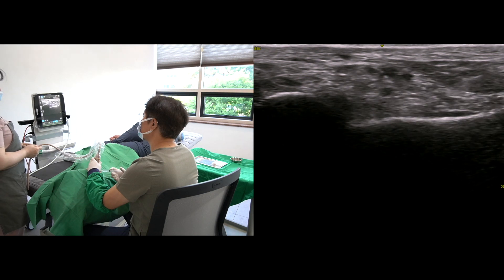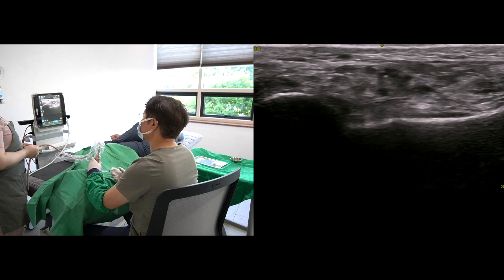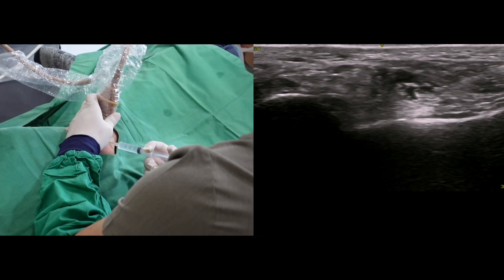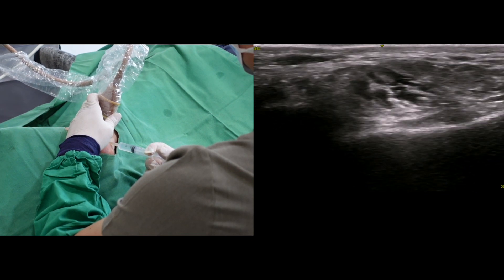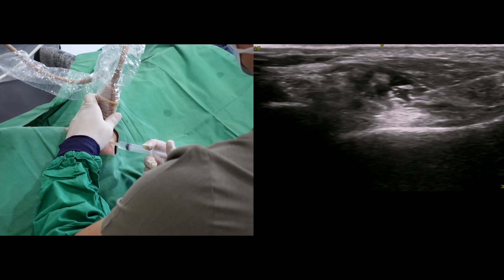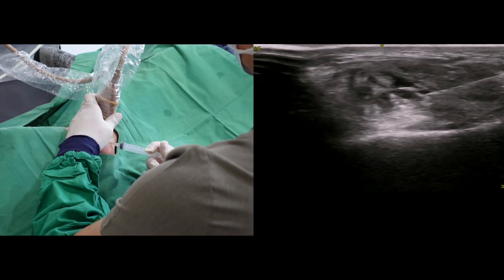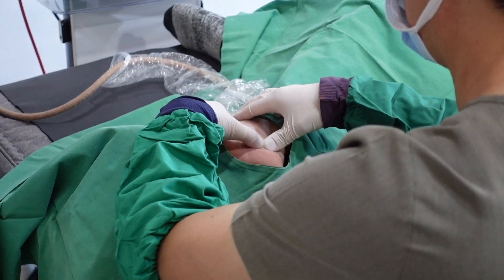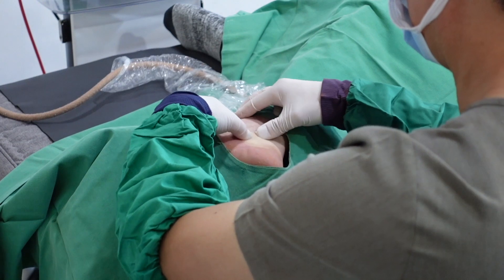If I push the needle tip without confirming its location, I have to prepare for a harsh complaint from the patient. Slow and steady fluid injection will infiltrate the interspace connective tissue and anesthetize the four branches. Gentle massage facilitates the spread of the local anesthetics.